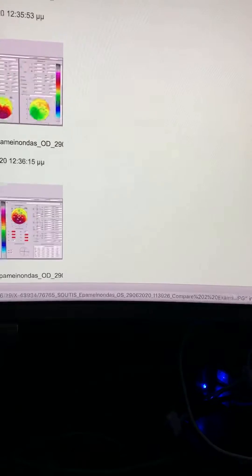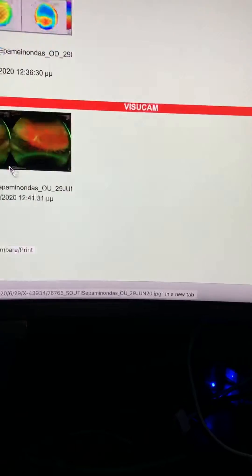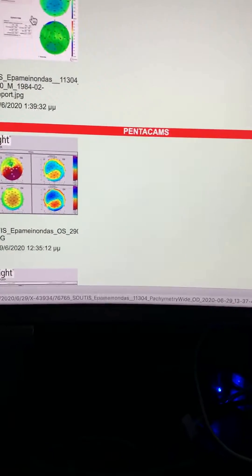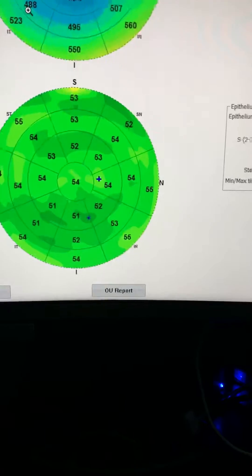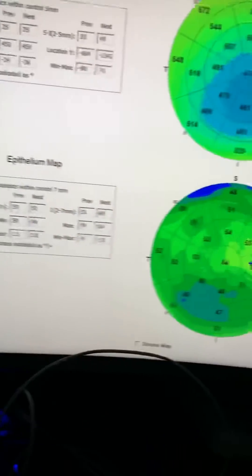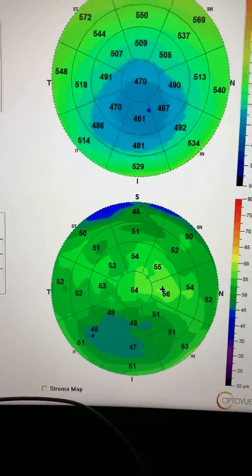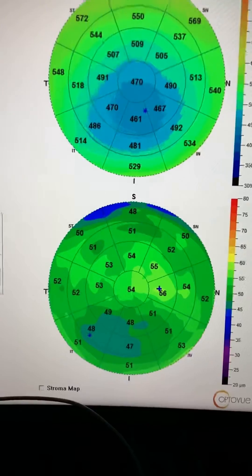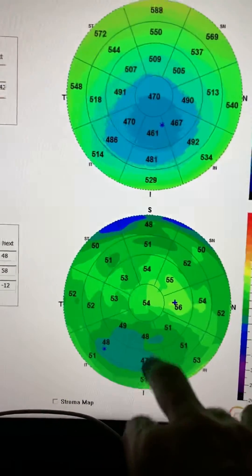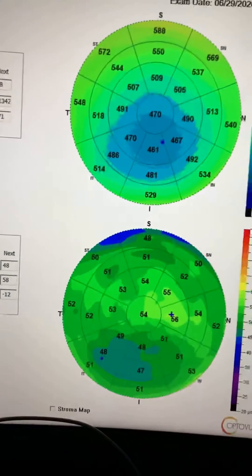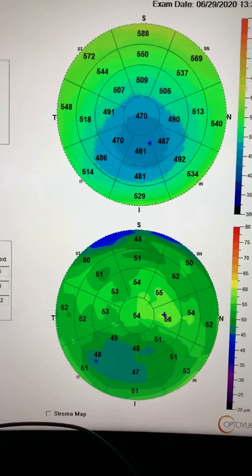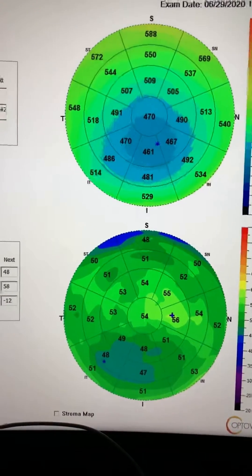And of course, we will wonder whether this changes from the contact lenses. So we're going to run and compare the epithelial maps and see that the epithelial maps are not that bad. These are the epithelial maps today. So they don't really explain the change in topography.